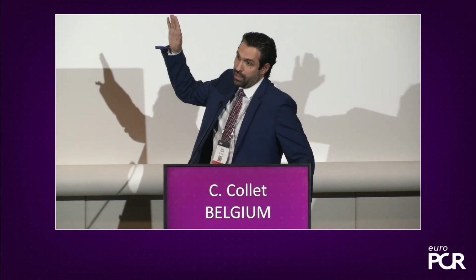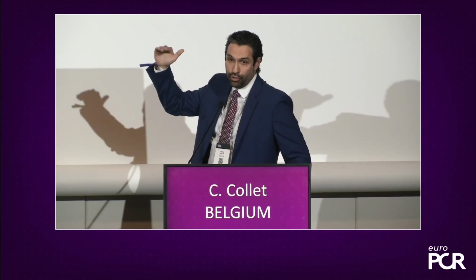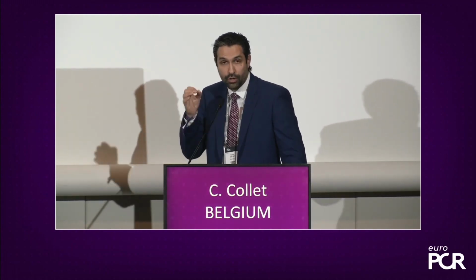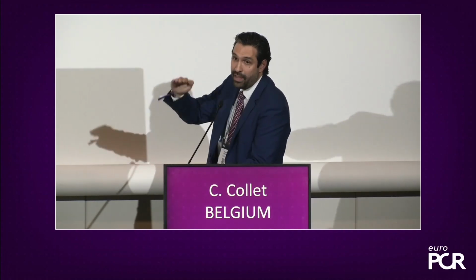I'm going to address it right away because it's not in the presentation. I think that when we measure post-PCI FFR, there is something that we have to have in mind, that is the fact that when the patient is lying down on the table, the LAD goes upwards, and that creates hydrostatic pressure that makes the pressure in the LAD systematically lower than in the right coronary artery. So the normal FFR in the LAD cannot be 1 by definition. Exactly the opposite happens in the right coronary artery, because when the patient is lying down, the right coronary goes downwards, and that increases the pressure due to the hydrostatic effect, and that increases your FFR.